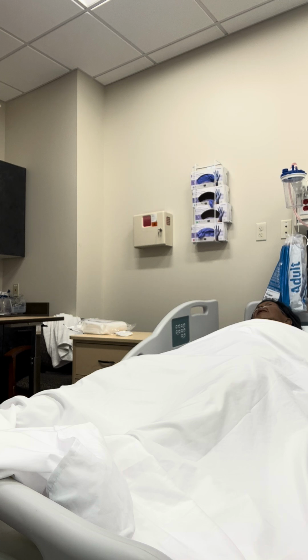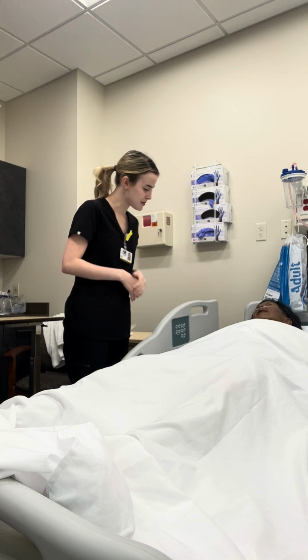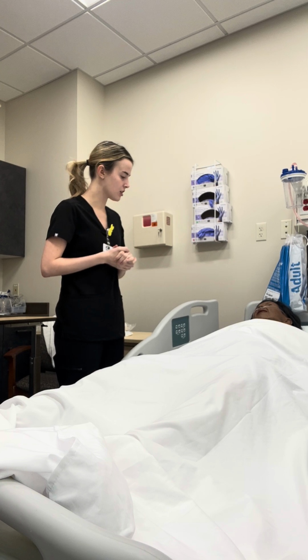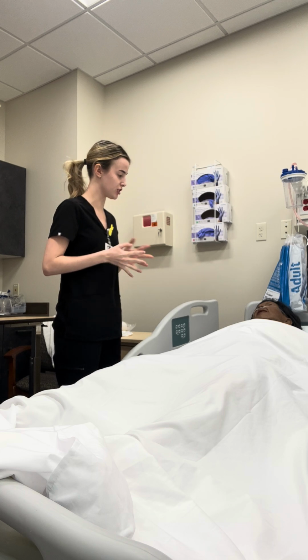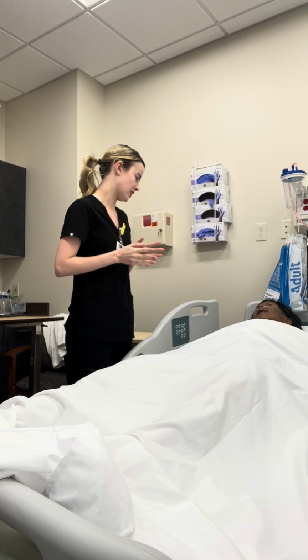So I would walk in, provide for privacy, doors closed. I would perform hand hygiene and then introduce myself to the patient. Hi, my name is Kylie. I'm a nursing student and your provider has ordered a urinary catheter for you today. So that is a tube that is inserted into the bladder through the urethra and it's just used to drain urine. So I'm here to do that for you. Is that all right? Okay.